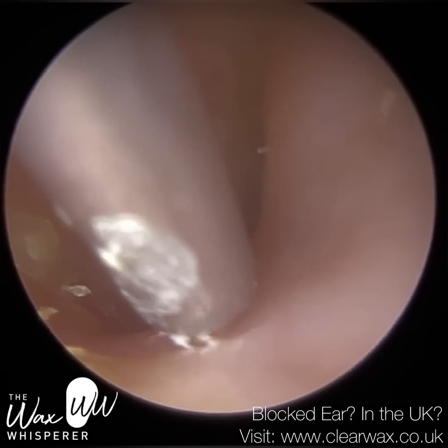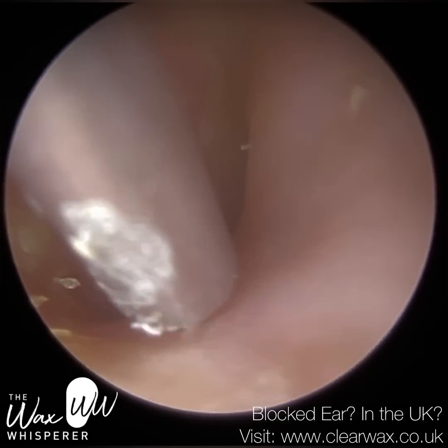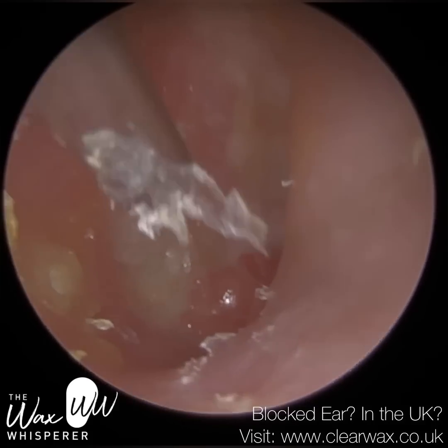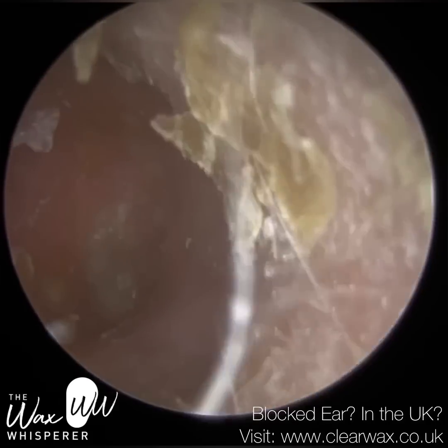So it's almost like a brand new ear canal. Just encrusted bits. If it's coming away, brilliant. If not, I'm not too concerned by this. This is the sensitive part of the ear, but because it's quite crusted, I had something to leverage onto there.